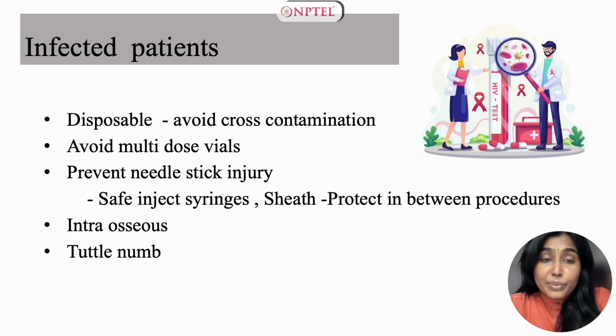And at any cost, prevent needle stick injury. Let's take adequate precautions by using safe inject syringes, sheath protect in between procedures. Also, let's choose techniques of delivering anesthesia which are minimally invasive. Intraosseous or even tuttle numb is a good option.